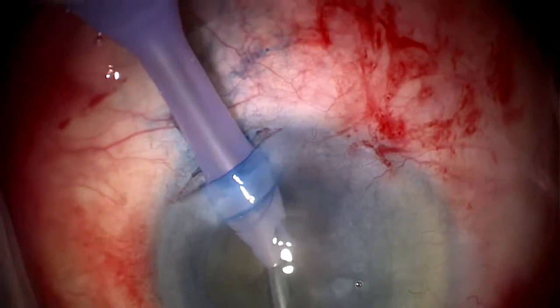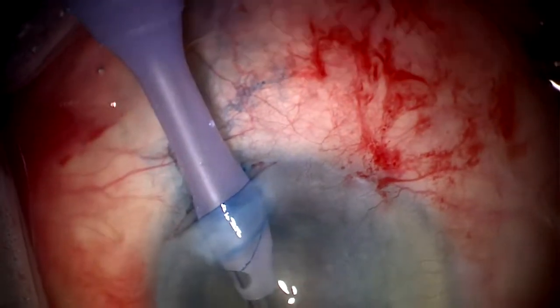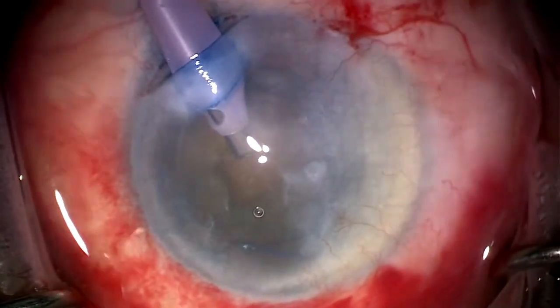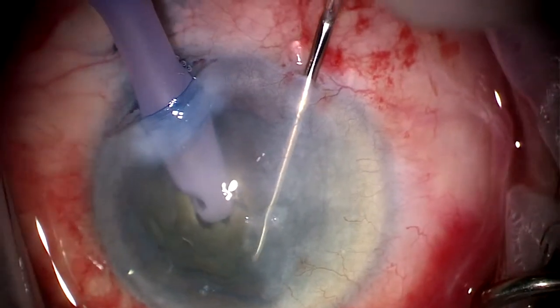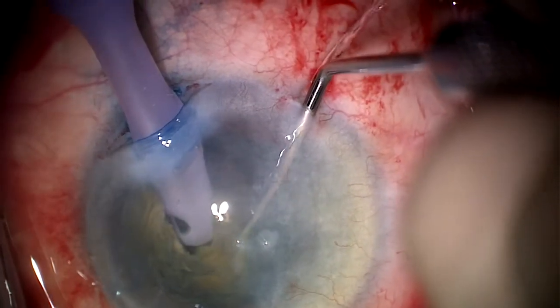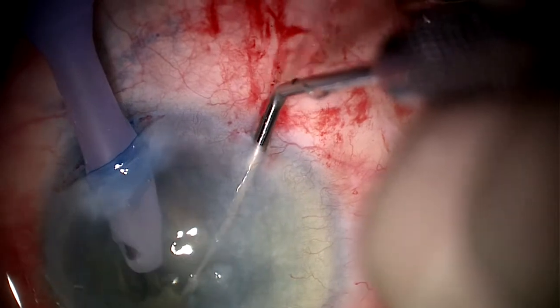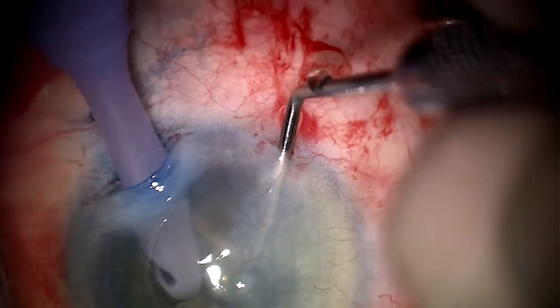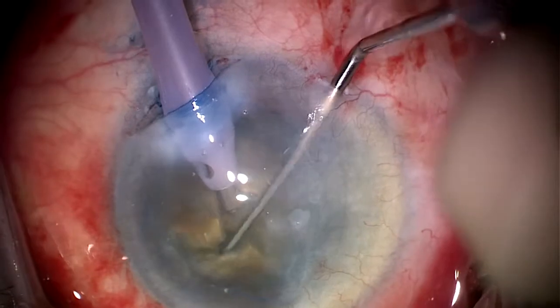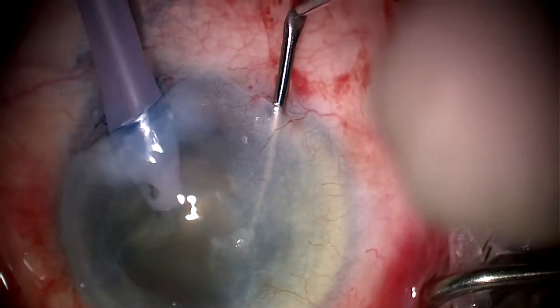We perform hydrodissection here to free the lens, and then we use a torsional handpiece, the Alcon Infinity System, as I think this is very good for dense cataracts in such complex cases. I like to create a little groove in the center in these cases to de-bulk the lens before I bisect the lens using a horizontal chop technique, which I believe is least likely to stress compromised zonules. We can see the lens being bisected into two halves. I also like in these cases to bisect the lens using the chopping instrument into as many small pieces as possible, and this really facilitates phacoemulsification using less energy.